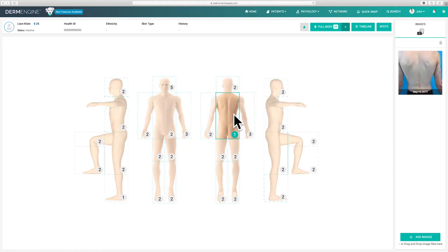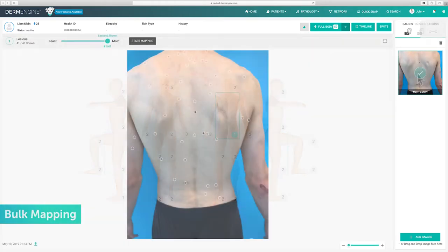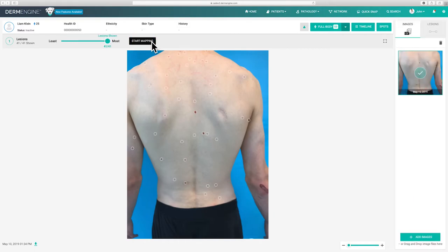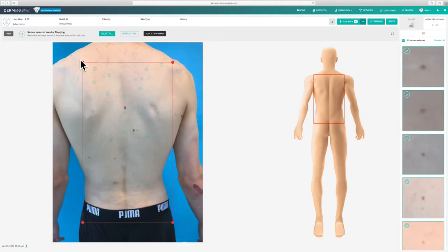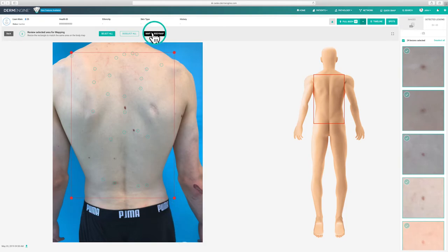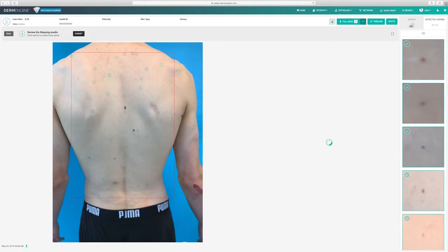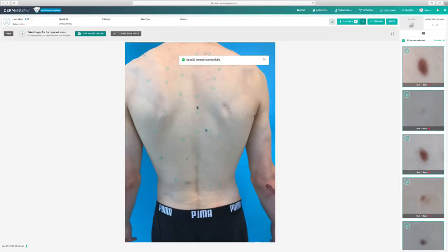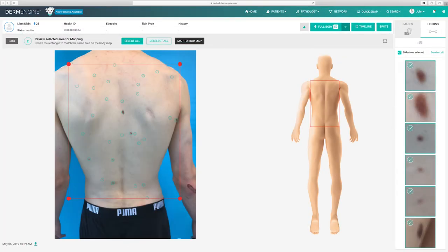For back images, you have the option of manual or bulk mapping. Bulk mapping is helpful for patients who have a lot of lesions that you wish to map to the 3D body map. To get started, adjust the slider to your preferred sensitivity and click start mapping. You can now resize the red rectangle to reflect the same area as the body map. When ready, select map to body map and once you're happy with the results, click submit. In other cases where you only wish to map a few lesions of concern, you can manually map these for a quicker experience. Simply click the lesions you'd like to map and click start mapping or the body map icon.